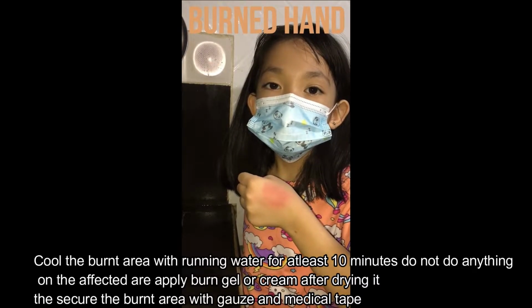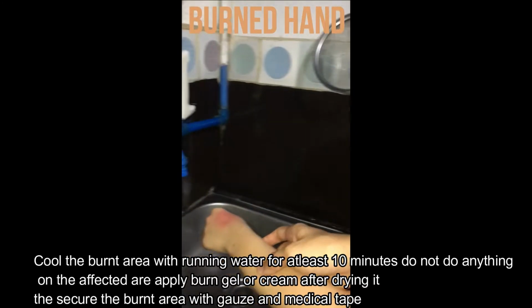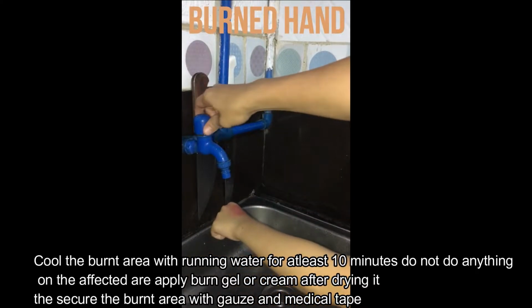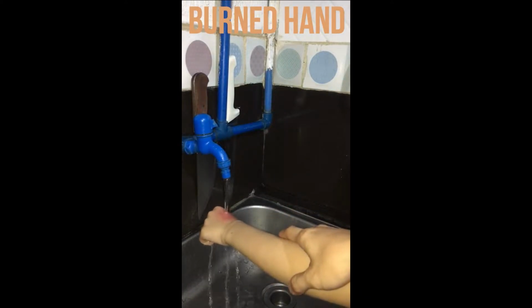For a burn hand injury, first, cool the burn area with running water. You may apply burn gel or cream after drying it. Then you may secure the burn area with gauze and medical tape.